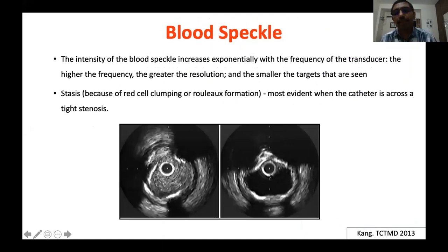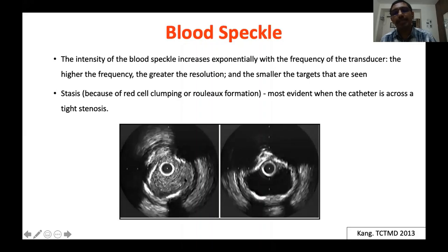Blood speckle artifact: when there is stasis or when using a high-frequency catheter, blood speckles appear much brighter, impairing your capacity to identify the lumen and intima-media interface. To see this interface clearly you have to inject contrast or saline to remove the blood speckles. Here is an example of saline injection — after injection you can clearly identify the interface.